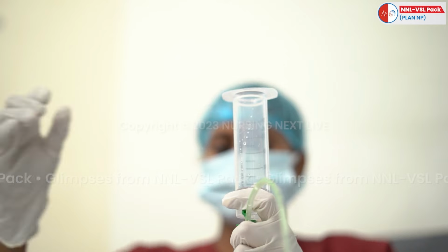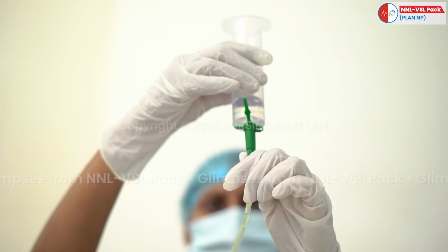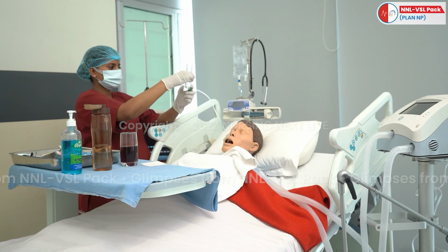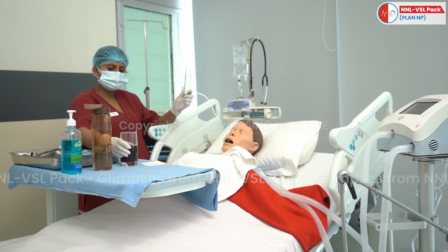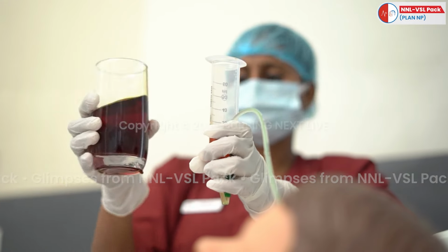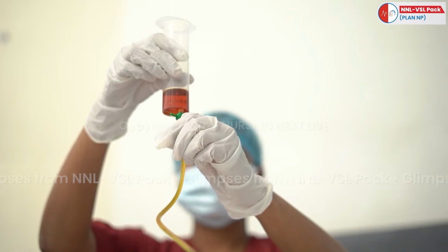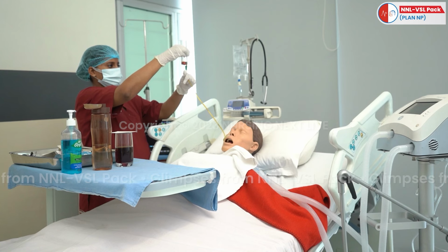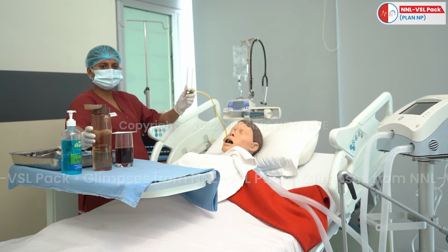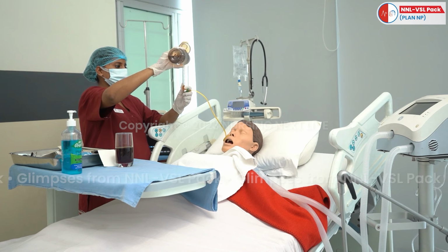After clearing, leave almost 3 to 5 ml of water in the syringe and then kink it and start pouring the feed in the syringe. After feeding, post-flush the tube with an appropriate amount of water. During the post-flush, leave almost 3 to 5 ml of water and kink it.